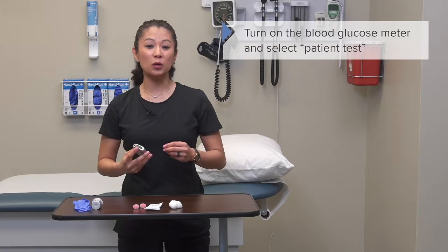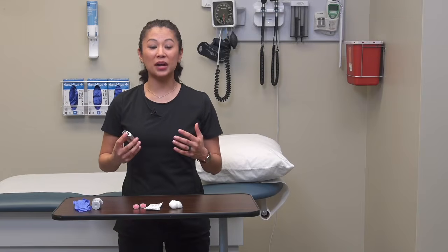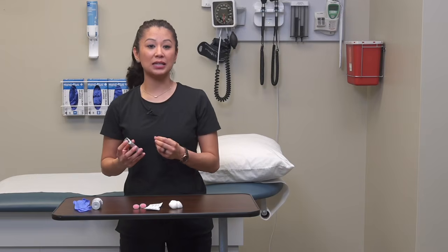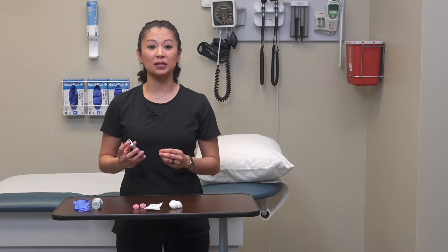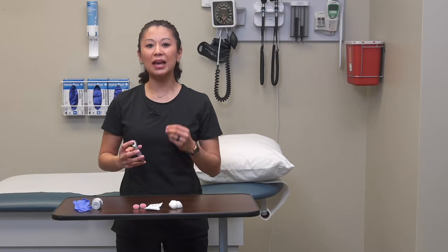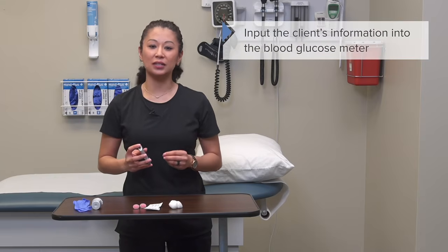Now, if I was using one in the hospital, we've got to make sure we've got the right patient. So on the display screen, you would see an option for a client test. So you would make sure you choose that option. Then after we did that, we have to make sure we input the client's information.